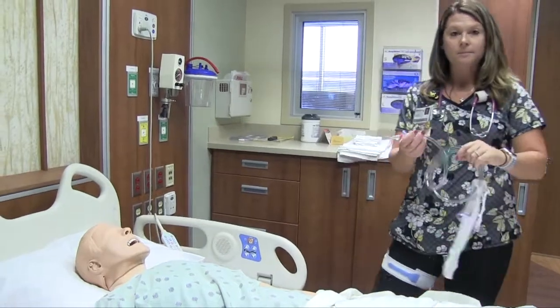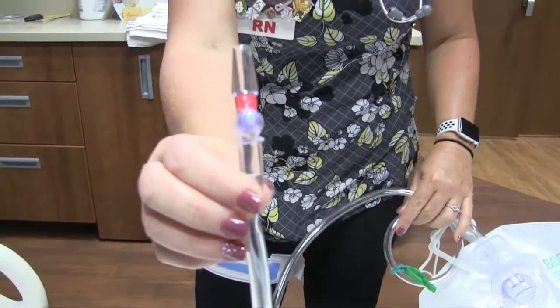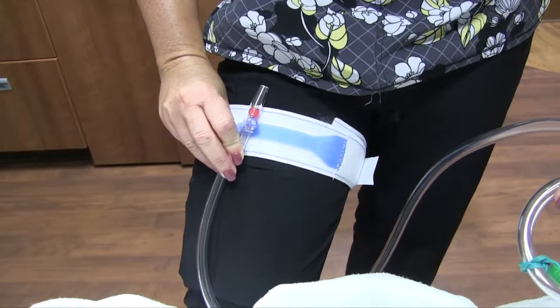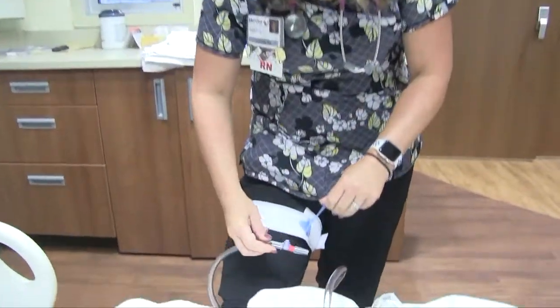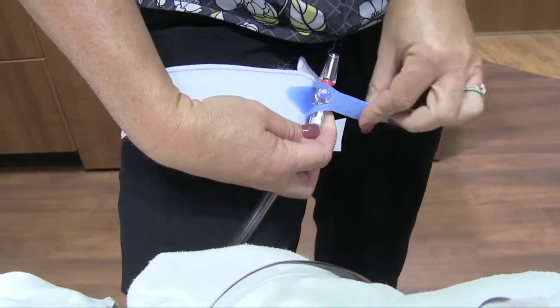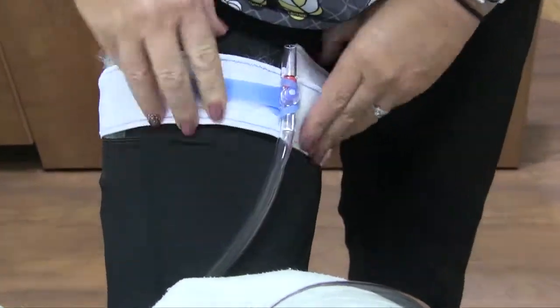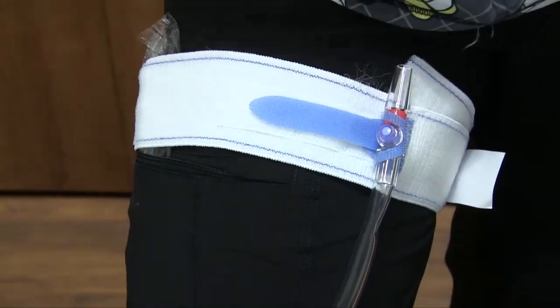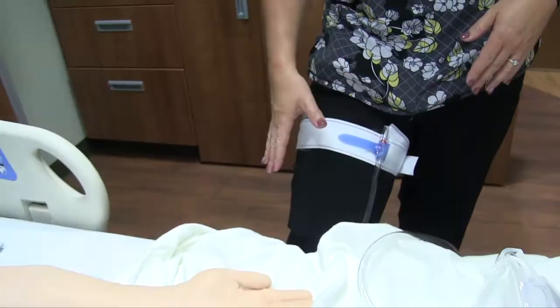So on this bag, you have a blue port. You see how the blue port matches this lovely blue strap? They are going to go together when you're at home. So your blue port goes right in there. Your blue strap wraps around and under. You pull it tight and it secures that catheter on your leg so you don't have movement that's going to disrupt your urethra. Okay, so it helps prevent any damage, keeps everything where it needs to be. Any questions over securing that?